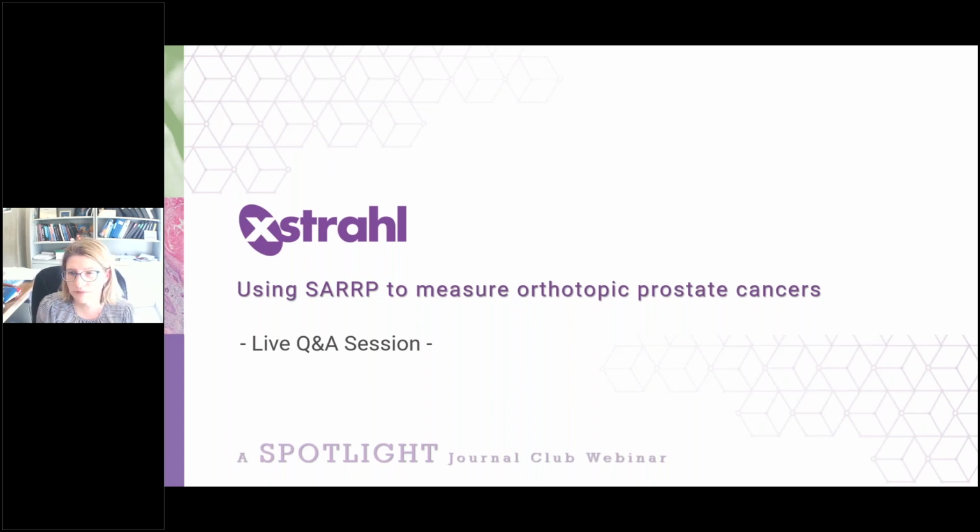Thank you. Now we have two questions that are quite similar. How much time does it take to do each mouse? And which method took more time for measuring tumor size, BLI or CT? For the time for imaging the animals, we could only do one animal at a time, and it takes about maybe 3 minutes in total to get the image and then to do the measurements. So you can get pretty quick doing it.